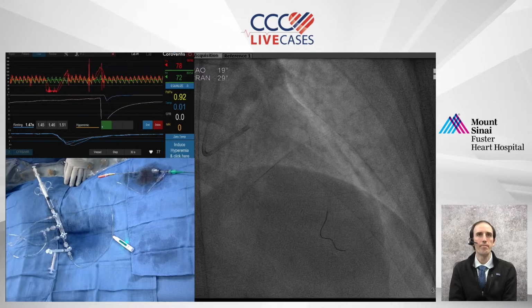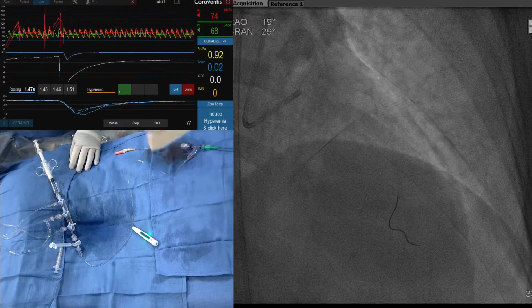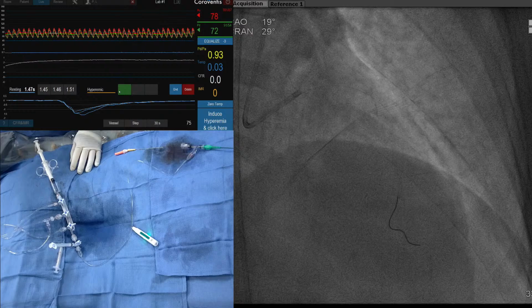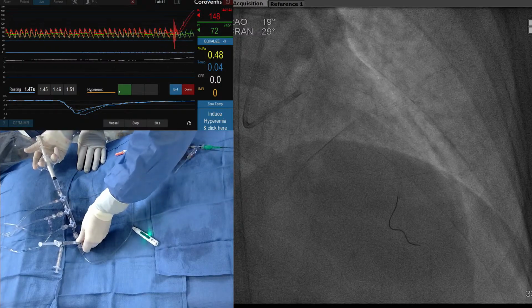I love it. Okay, so now we are going to induce hyperemia. We're going to open up those microvascular vessels. Go ahead, Ashley, you can start. We typically do this at a dose of 140, and we're going to look for hyperemia. So we're going to see a separation in your Pd/Pa. You're going to see an increase in heart rate, a drop in the blood pressure overall, and symptoms. Those are the things that we typically look for. And then once we hit hyperemia, we repeat our flows, and then it's a simple equation.